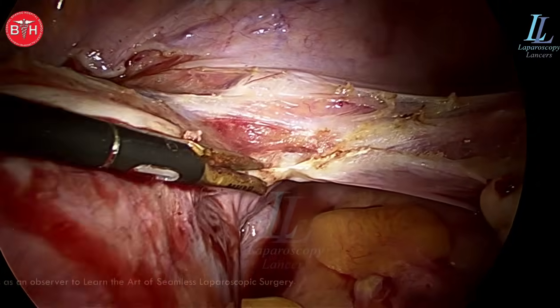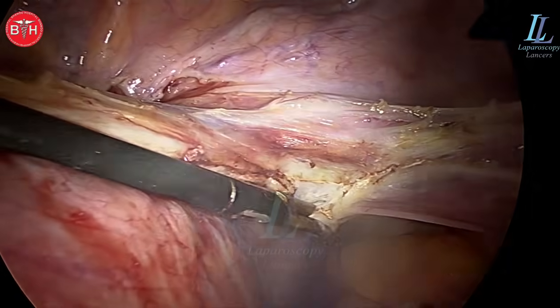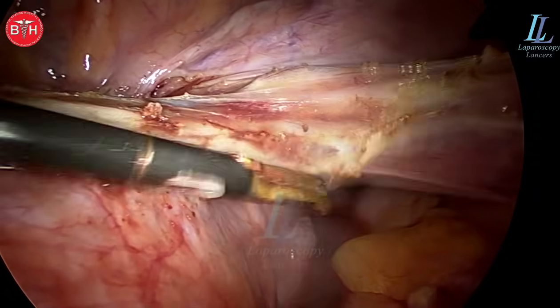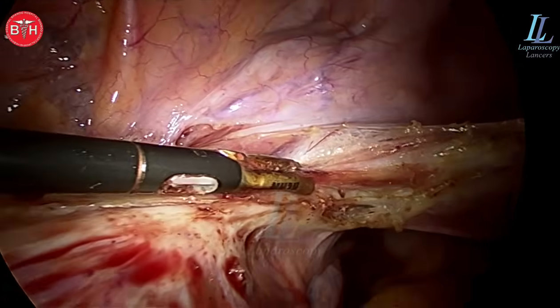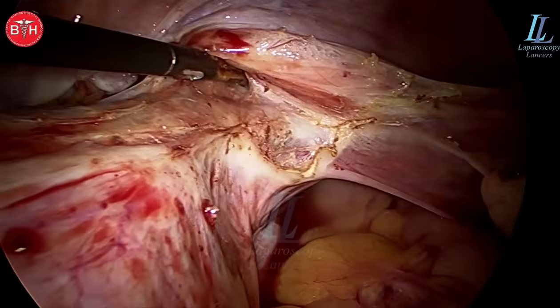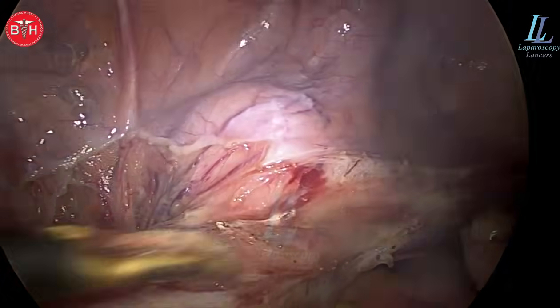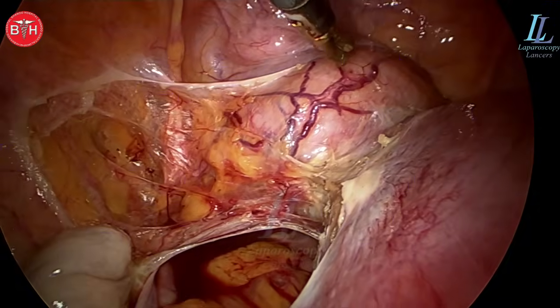Look how easy it is. You may feel that I make it look easy — it is actually easy — but you should learn it step by step. You should know what is actually happening, and seeing the YouTube video only will not help. You must come and see how the surgeon or gynecologist is operating: all the pros and cons, how the shoulders are working, how the camera assistant is working. There I have dissected the bladder — a bit of short burst of energy, very very short burst of energy should be used, else chances of VVF formation are very high.